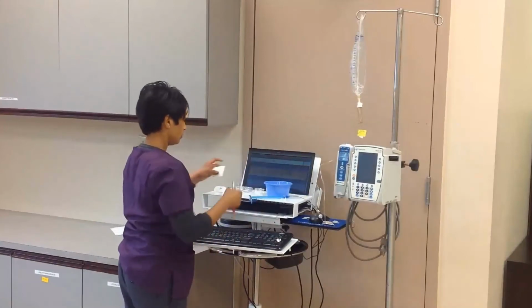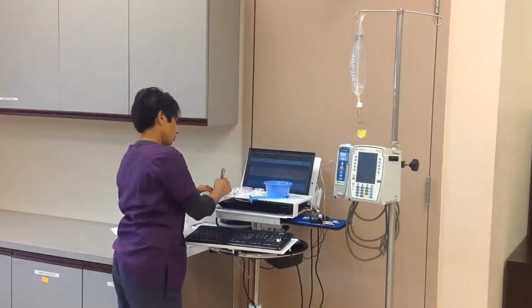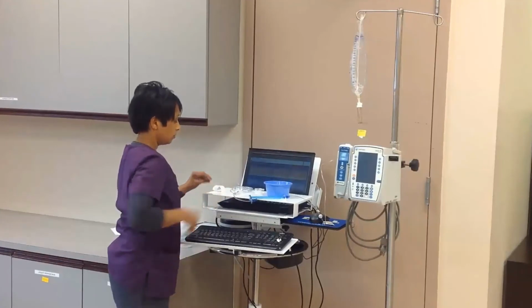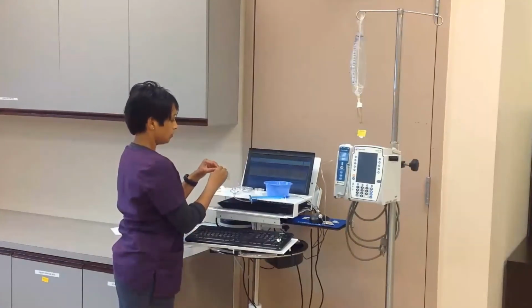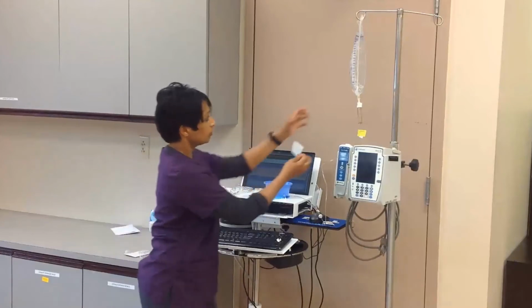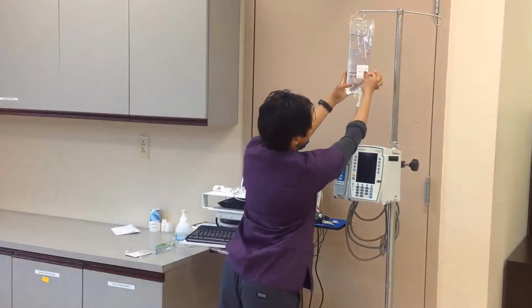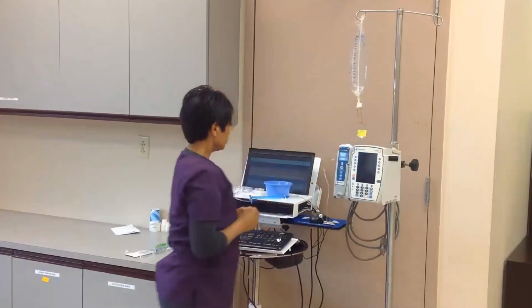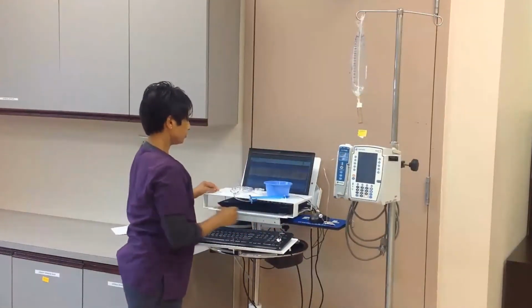Label the white medication label with the patient's initials and the date and time you are hanging the solution. Remember that an open bag of IV fluid will expire in 24 hours unless otherwise indicated. Place this label on the back of the IV fluid bag. Never place a label on the front where it will obstruct important information about the solution.